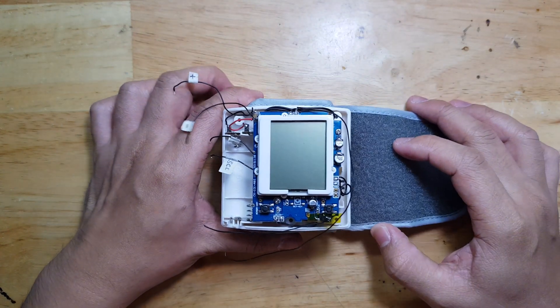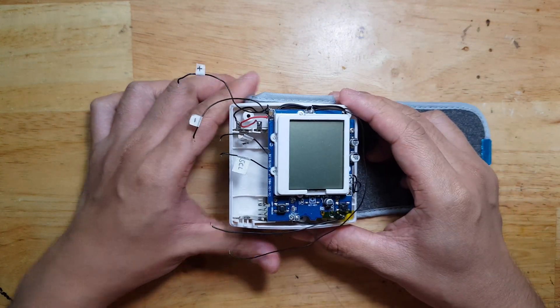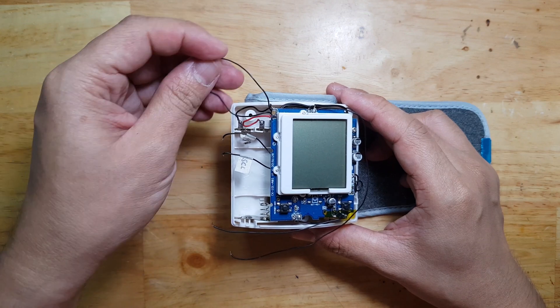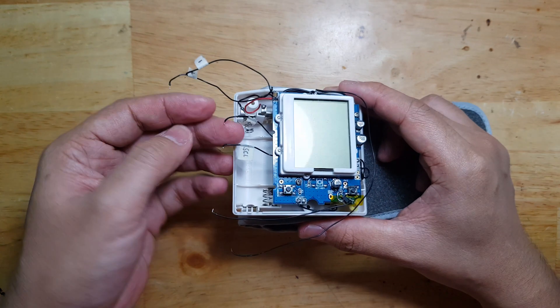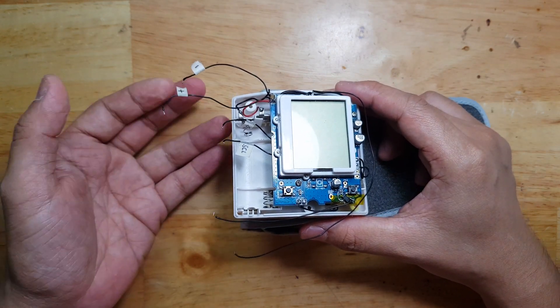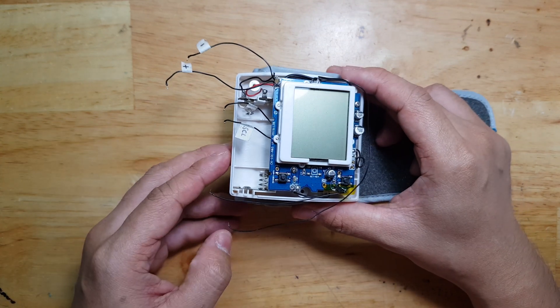In the last video, we opened 3 different blood pressure monitors and checked where we can hook the I2C from. Now we will proceed on connecting these wires to the Arduino and how we can read the values and do some meaningful applications.